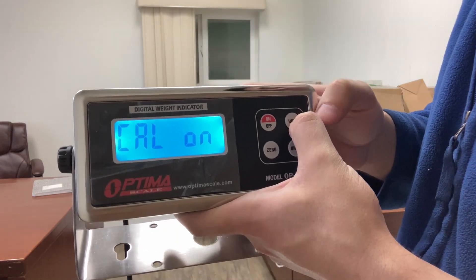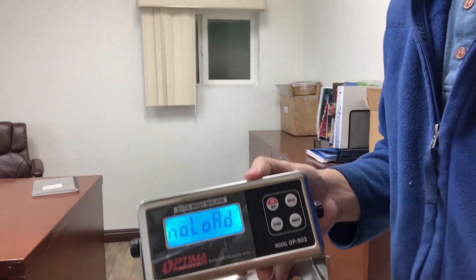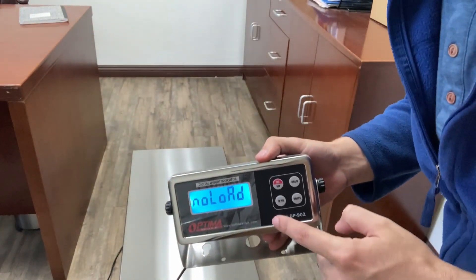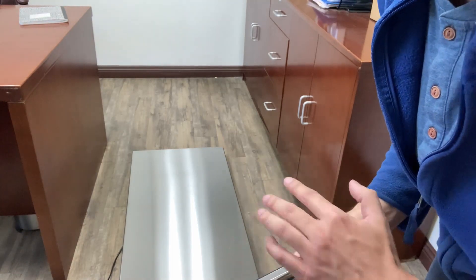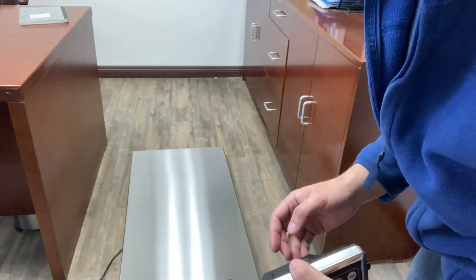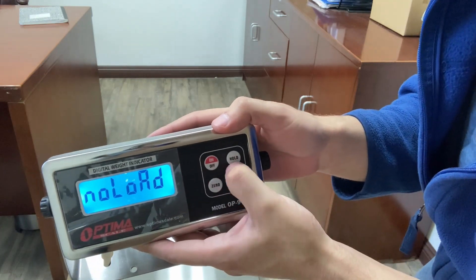It'll say cal on — that's good. Press hold again. So now it says no load. Check your scale — there's nothing on it. Make sure it's clear of everything. You'll see no load; that's fine, that's good. Press hold.